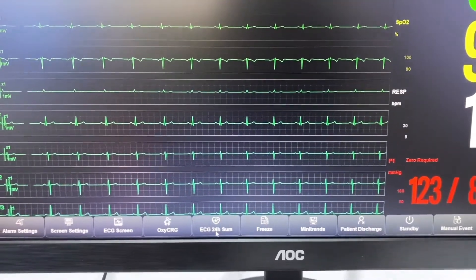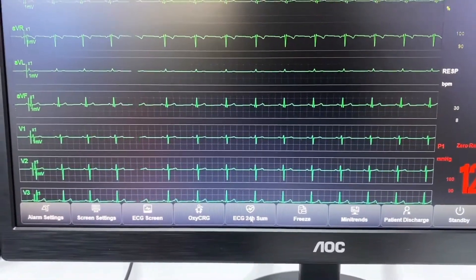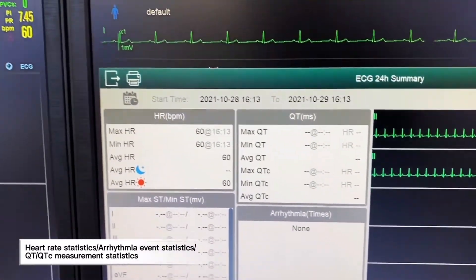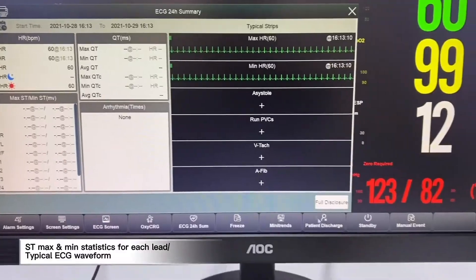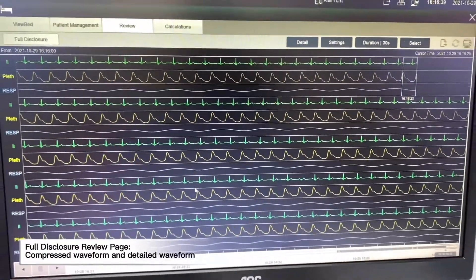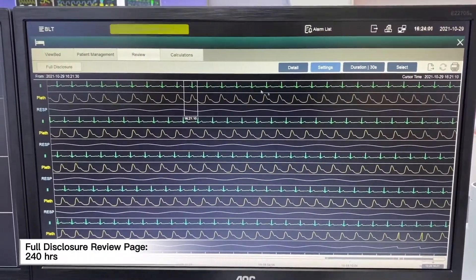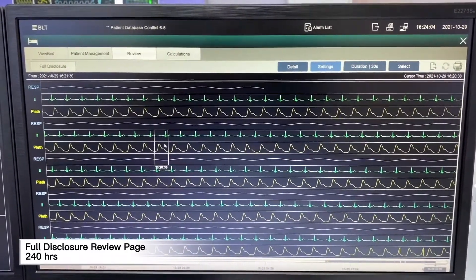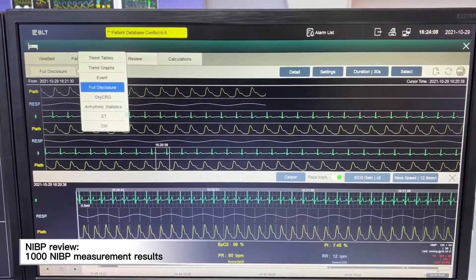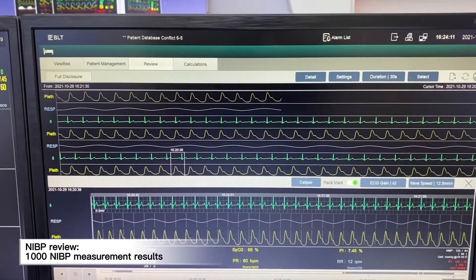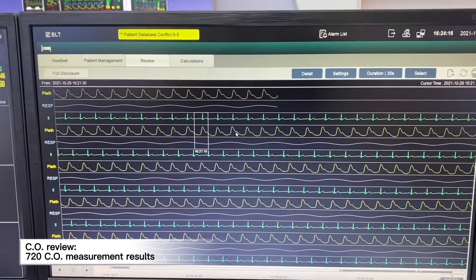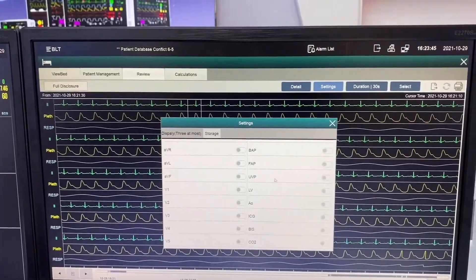After monitoring a patient's ECG for a period of time, we will be able to see the ECG 24-hour post summary page. We can open full disclosure, which supports up to 240 hours. For NIBP review, it supports up to 1,000 NIBP measurement results. For cardiac output, it supports up to 720 cardiac output measurement results.